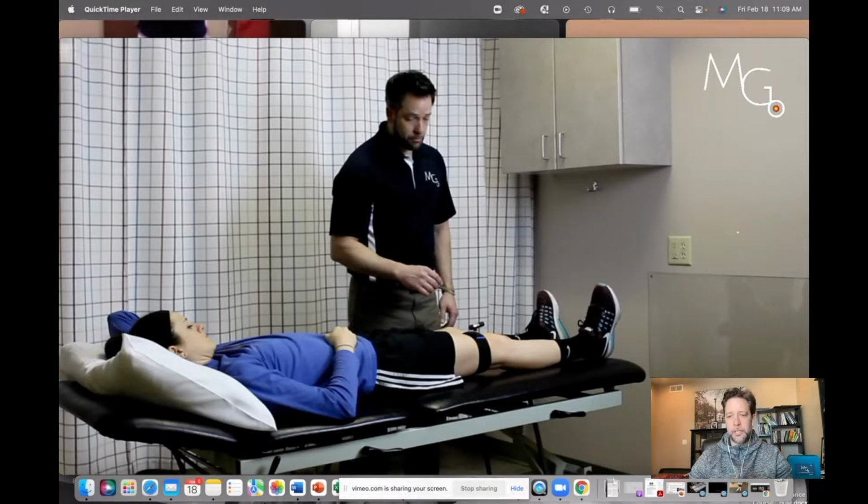I'm going to put this on the thigh, but a set distance from the kneecap. Oftentimes I just use the distal phalanx of my thumb, and I measure up 3 joint lengths from that, and that's where I apply the Motion Guidance strap. Then I'm going to use the flat mount, and then the laser put on top of that.